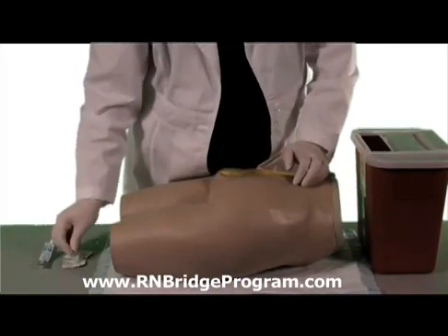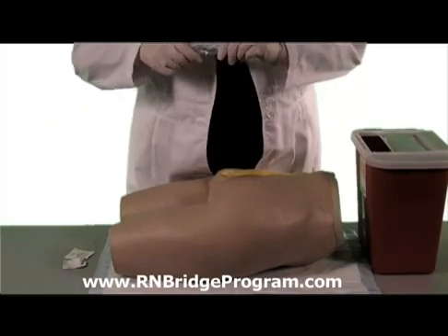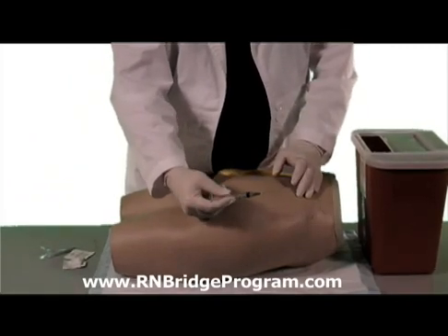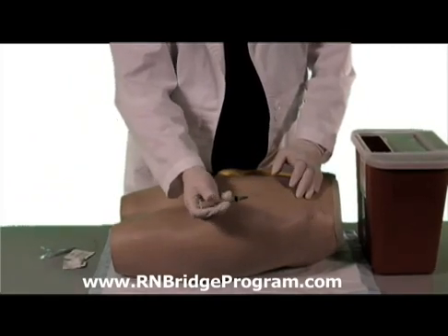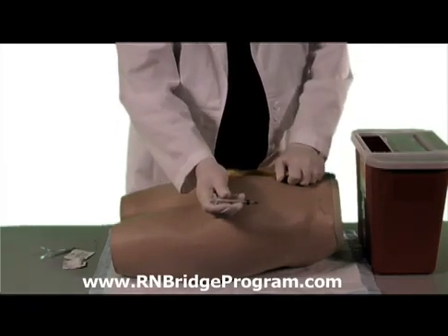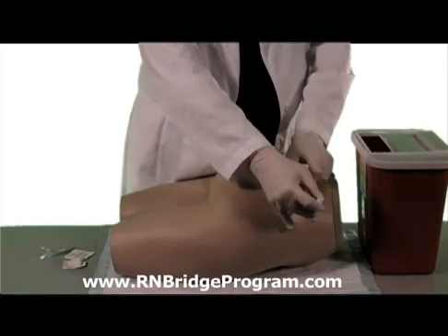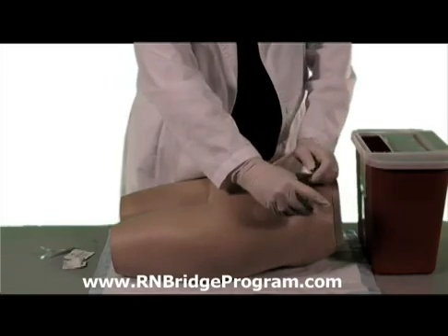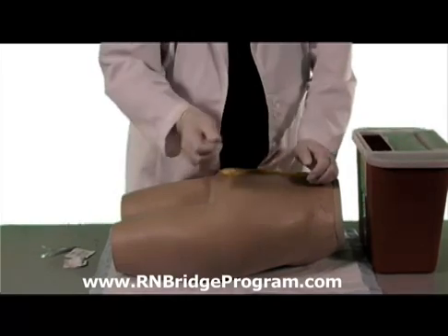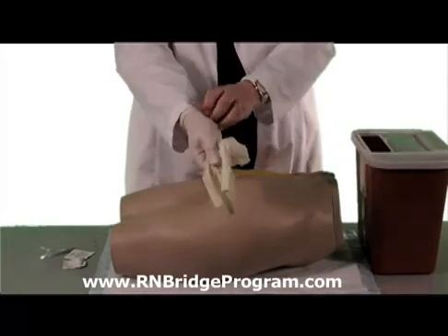We're going from clean to dirty. Then take your needle with your medication. Make sure that you turn the bevel up — the bevel is where the hole is in the needle, and it goes up towards the patient. You are going in at a 90-degree angle, directly in, aspirate to see if you have any blood, and then immediately inject. When you finish, pull your needle out, put it in the sharps container, take off your gloves, and then you're done.